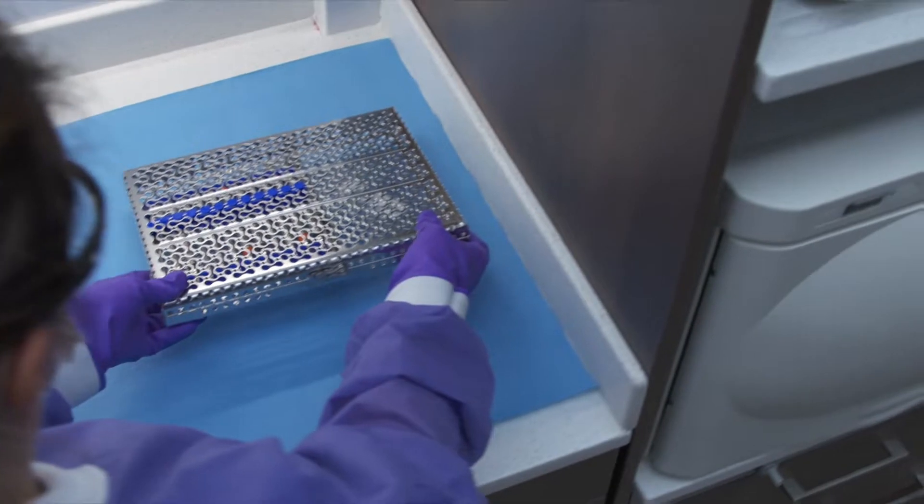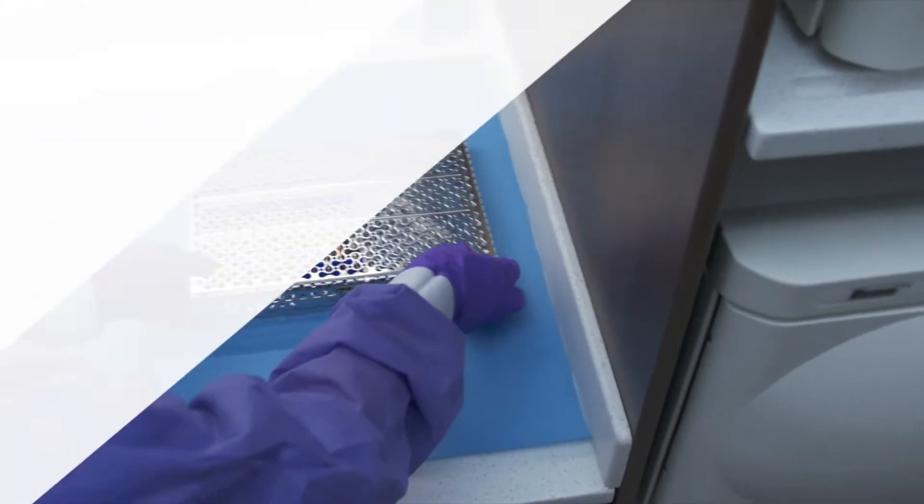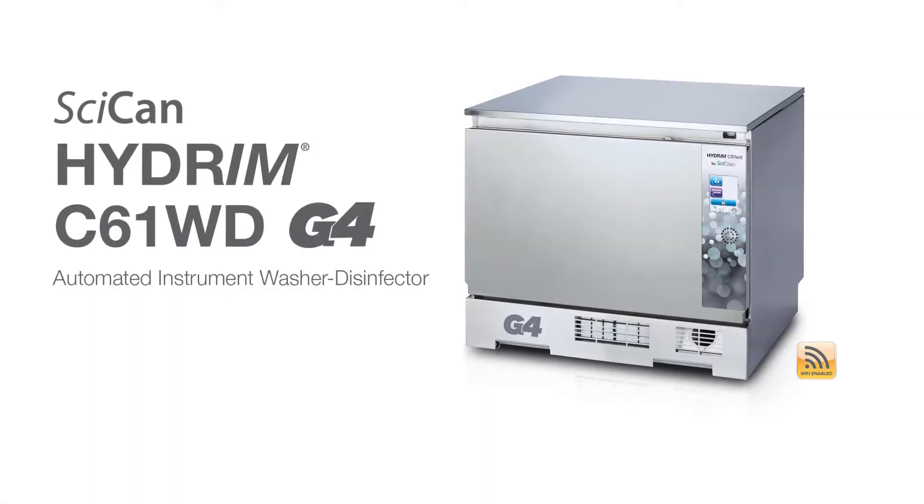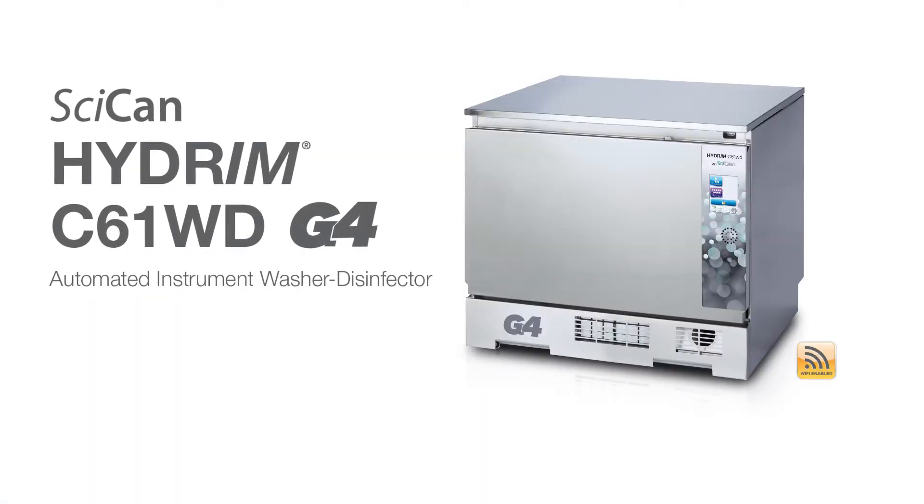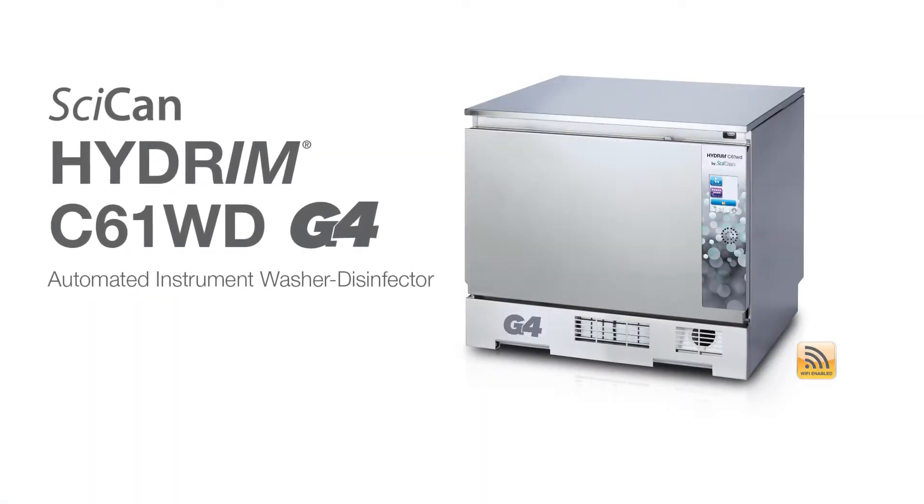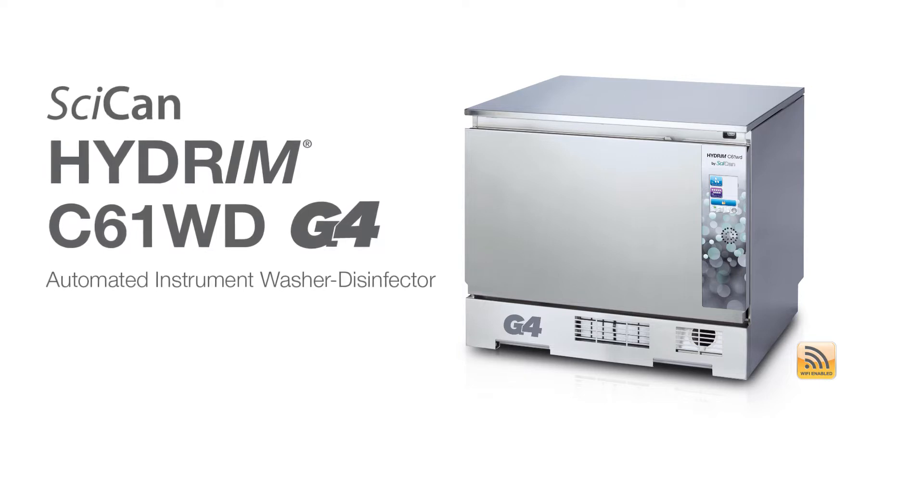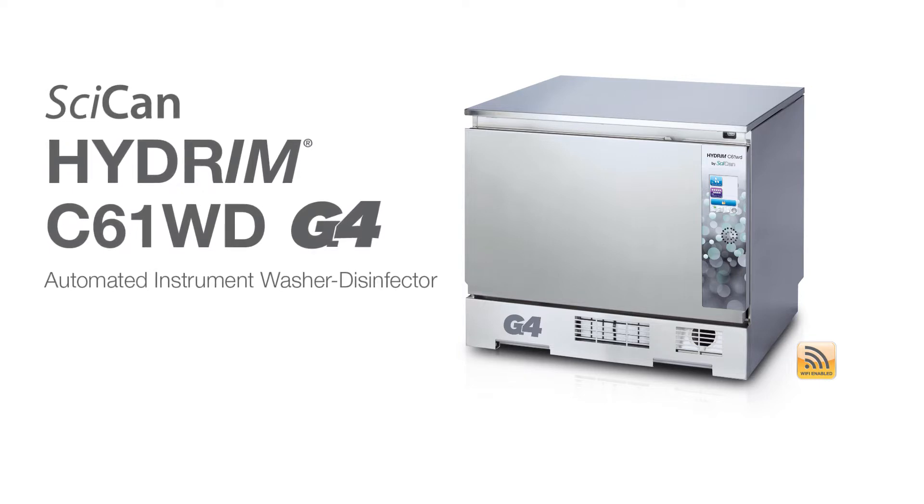Every set of instruments receives the same validated cleaning and disinfection process with each cycle by dosing the correct amount of detergent. This allows instruments to immediately be transferred to the next step of instrument reprocessing: sterilization. Your Hydrum C61wd comes with the following items.